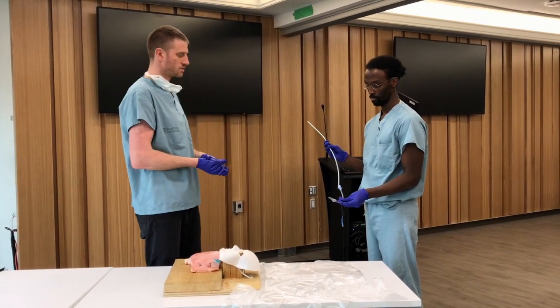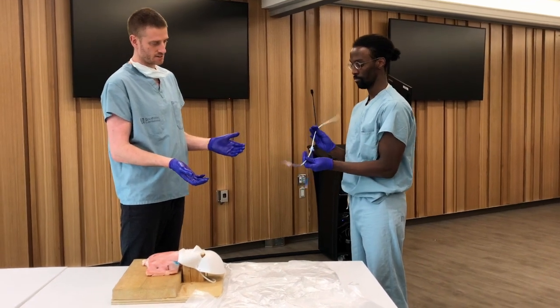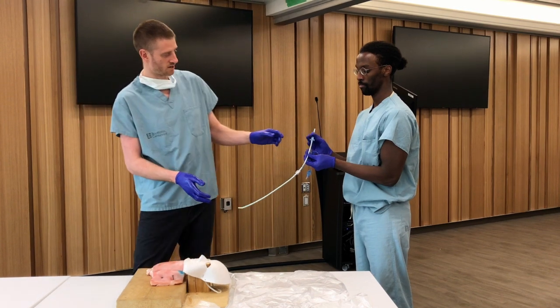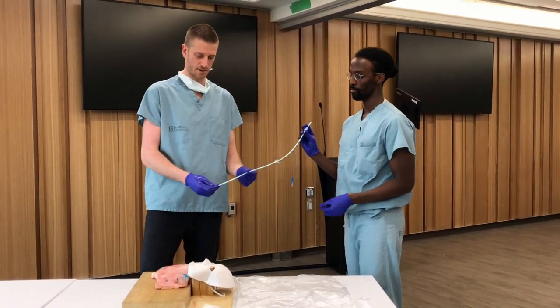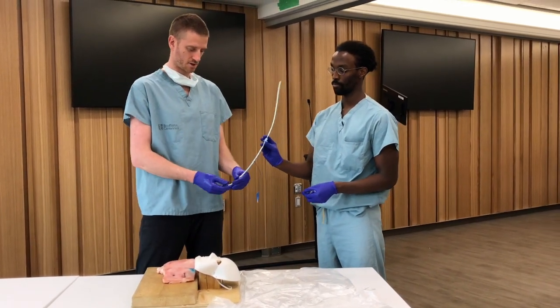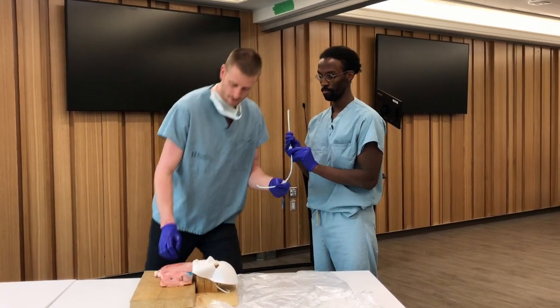So as my assistant, Osman is going to load the ET tube onto the bougie before I've even really started, okay? And as you've seen here, he's moving the ETT quite high on the bougie. So if he passes it to me now, I've got a lot of room to work with. If he were to pass it to me with the ETT down here, it's getting caught on things. It's not going to pass well, okay?